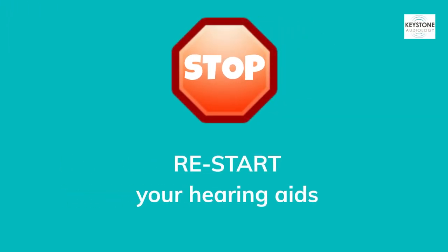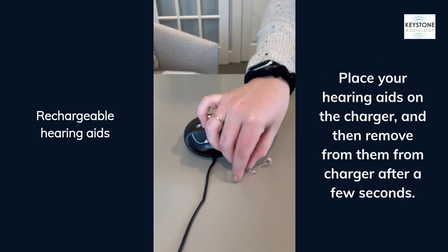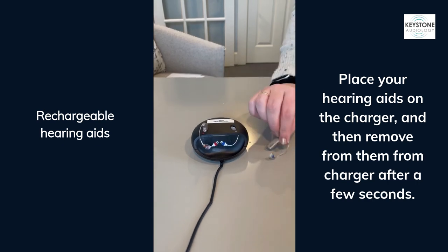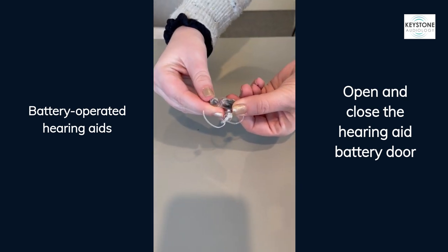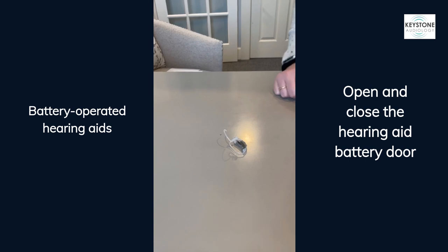Stop here for a moment to restart your hearing aids. To restart your rechargeable hearing aids, place them in the charger and then remove them after a few seconds. To restart your battery-operated hearing aids, simply open and close the battery door.